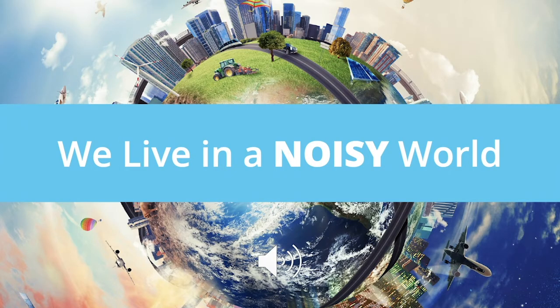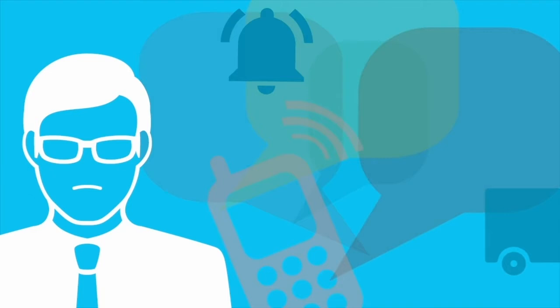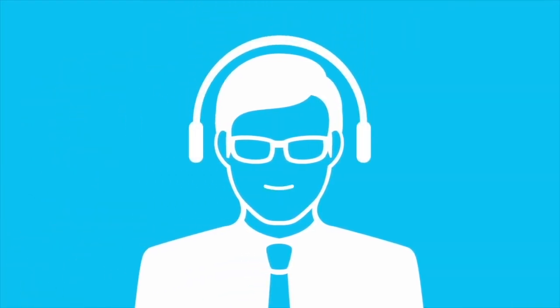Assistive listening systems do not simply make presentations or announcements louder. They are designed to make it easier to hear and understand. While each system is different, the basic function remains the same. A transmitter, either portable or permanently installed, broadcasts the audio to a receiver. The receiver sends the audio directly to the user via headphones or directly to their hearing aid. Receivers are either provided by the facility or guests can use their own smartphone.